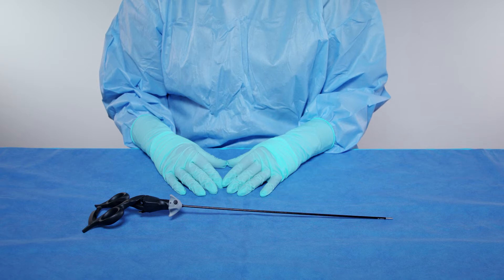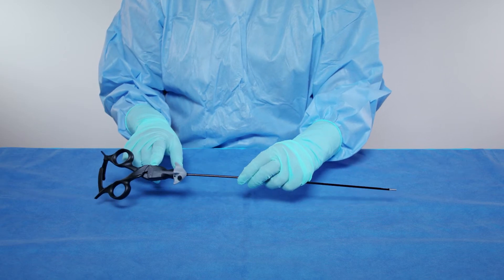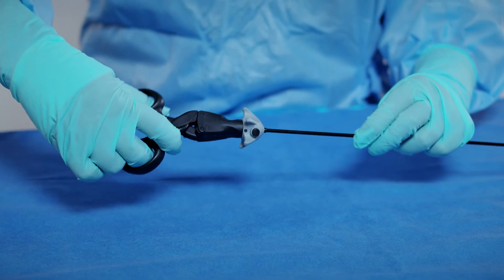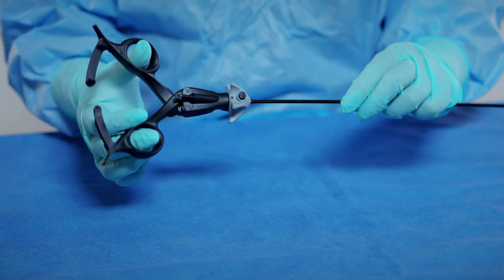The same steps apply for disassembling an Aragon Axial Handle from the sheath tube. Ensure the handle is fully open and that your hands do not restrict the handle from opening as you separate the sheath tube from the handle.